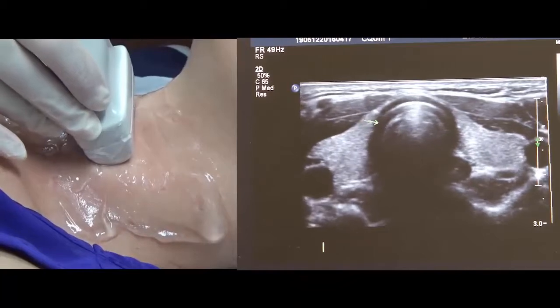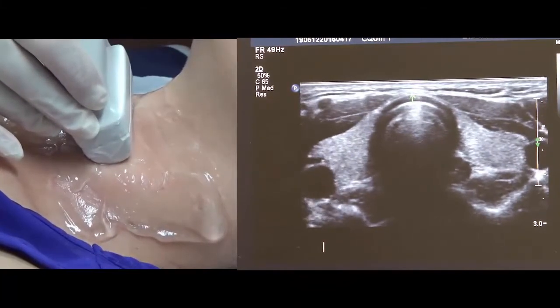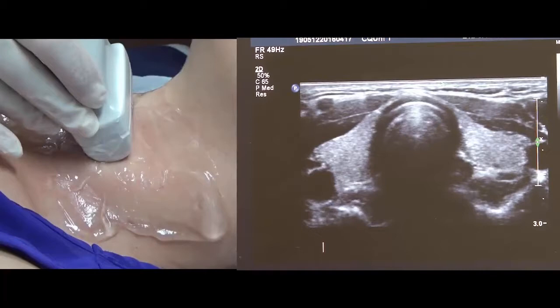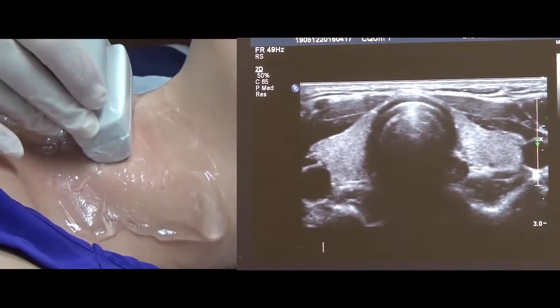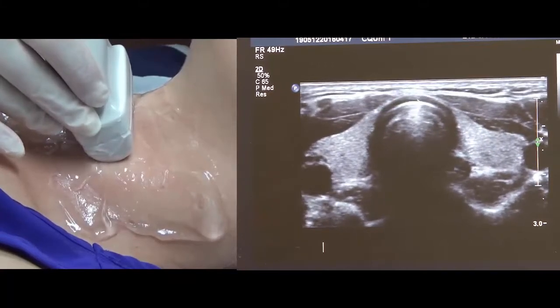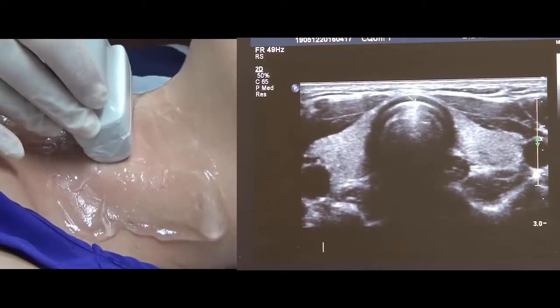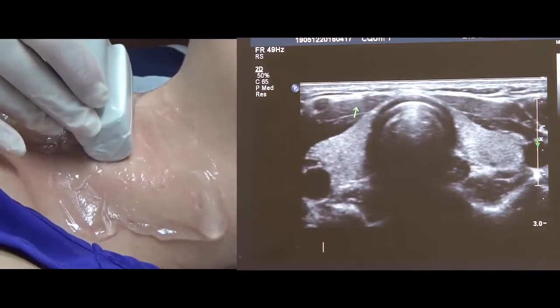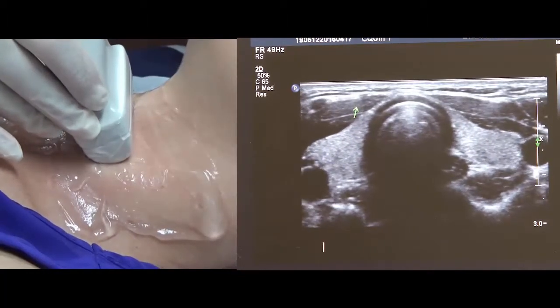Now you're going to get reverb because look how superficial that isthmus bridge is. It's tiny, there's hardly any subcutaneous fat, and we've got the skin line here as a really nice thin layer. So you're going to get reverb. Don't be too concerned about that isthmus and having the reverb. Then we've got this space here, which is the cartilage, which is going to be anechoic space, and the tissue of the isthmus just drapes over anterior to that cartilage there. So we've got all of our landmarks. We know we've got our strap muscles here, and we're in a place to start doing our survey.